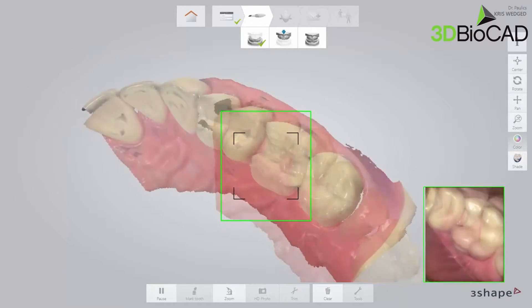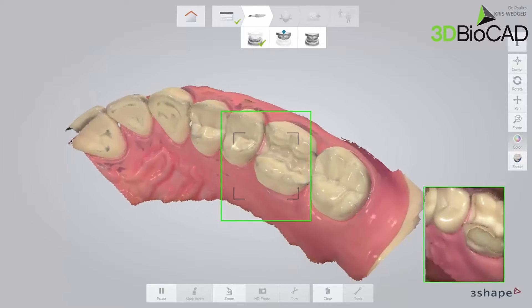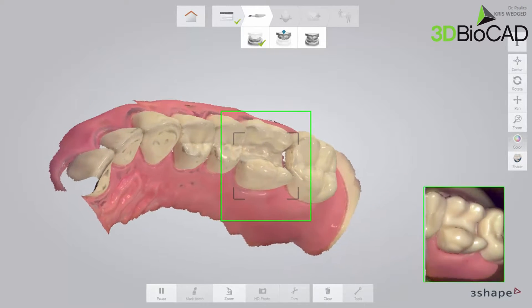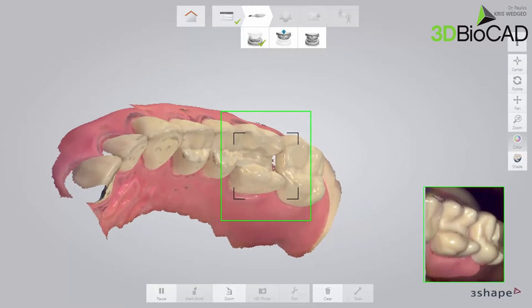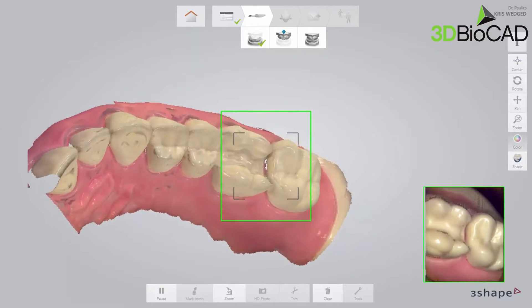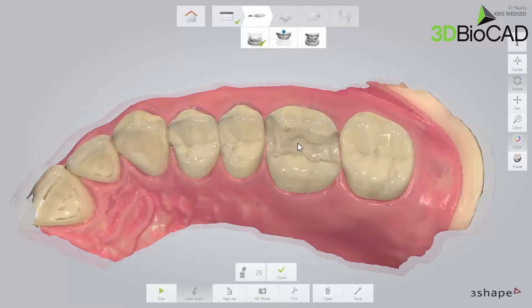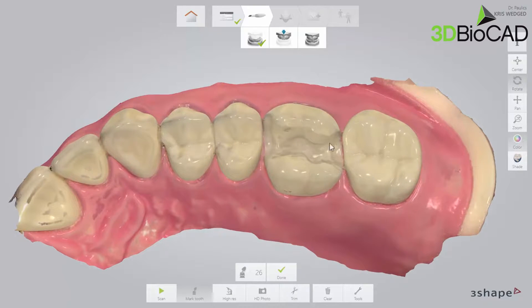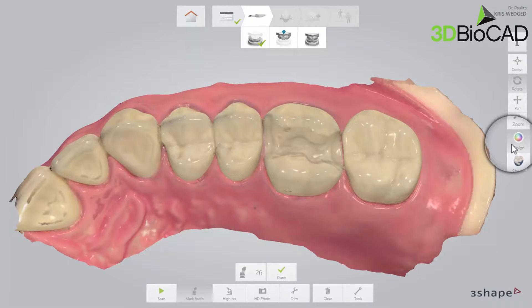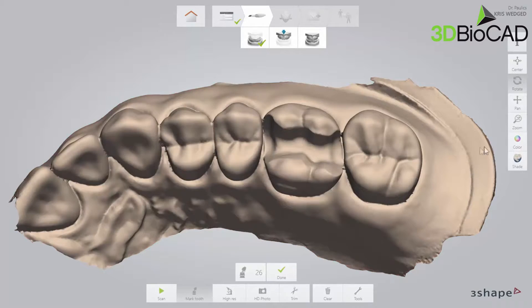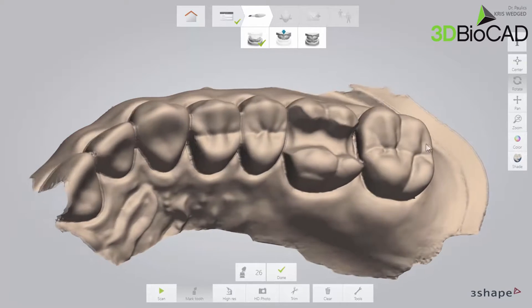Make sure that you cover the prepped area, including the margin line and contact points. Do this by zooming in on the preparation, turning off colours, and rotating the preparation.